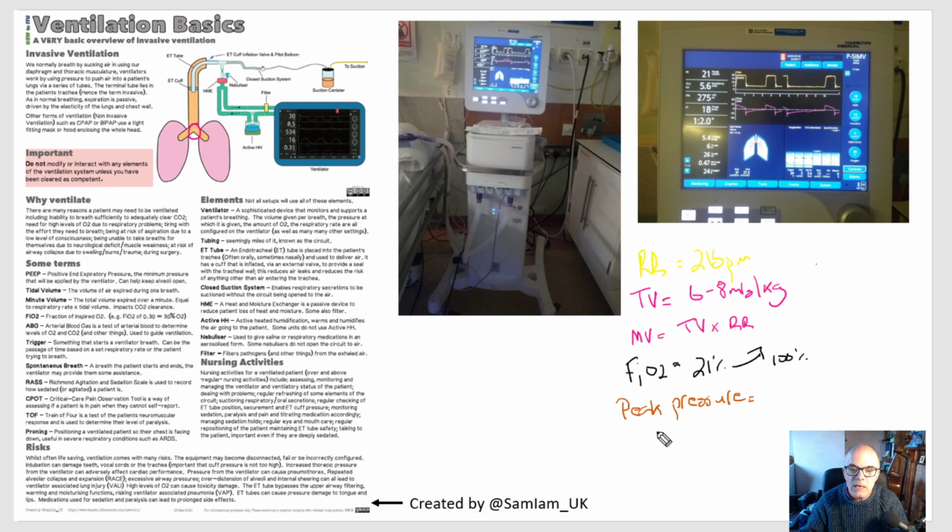So these are the key things on the ventilator that you can see on here, which is what the machine's telling us, and it's not very clear on here. You can see on there, that's what we're setting in the machine. So we're adjusting these numbers here, and that's what the machine is telling us is coming out. I'm not going to go into the waveforms. Again, if you're not experienced with ventilation, probably waveforms is a bit too much anyway. So that's the basics. That's what the ventilator is doing. And if you just think of a ventilator as a leaf blower, but with some restrictions on what it can and can't do, which is set by us.